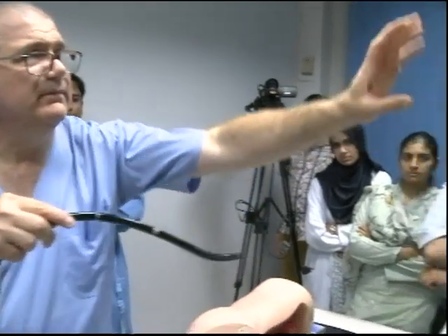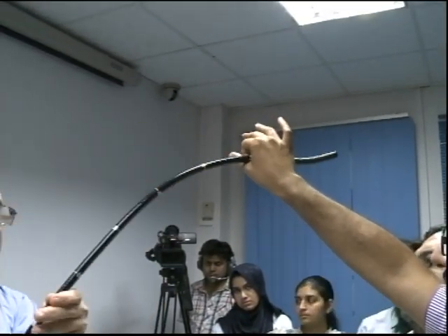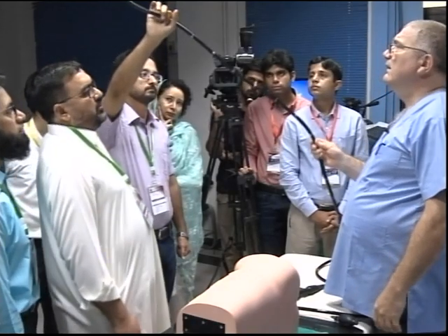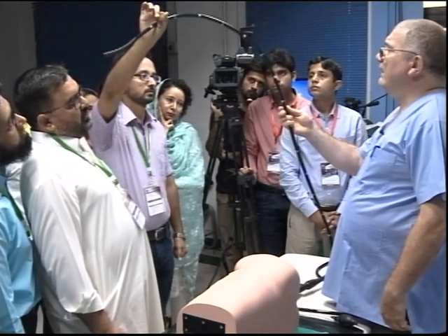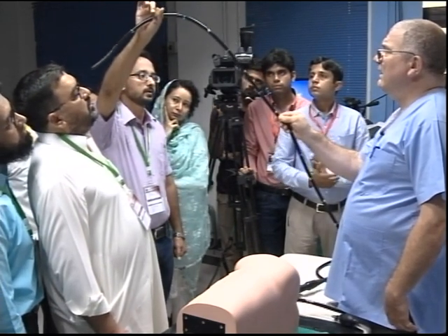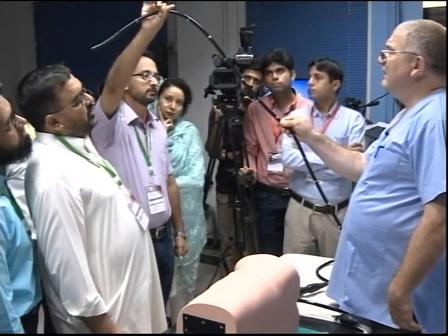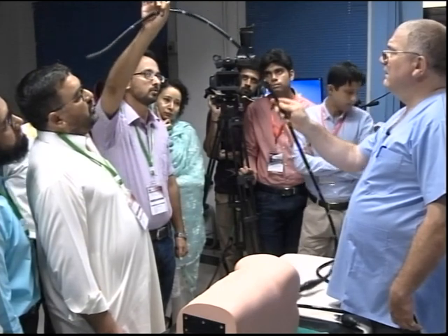So, put your hands up. Do that. Let me pop it in. How does that feel? Don't have to grip it too tight. See it? It's relaxed. Now feel it as I do this, and then do that. How does that feel? A bit stiff. Stiffer? Yeah. How does it feel now? Stiffer? No, relaxed now.